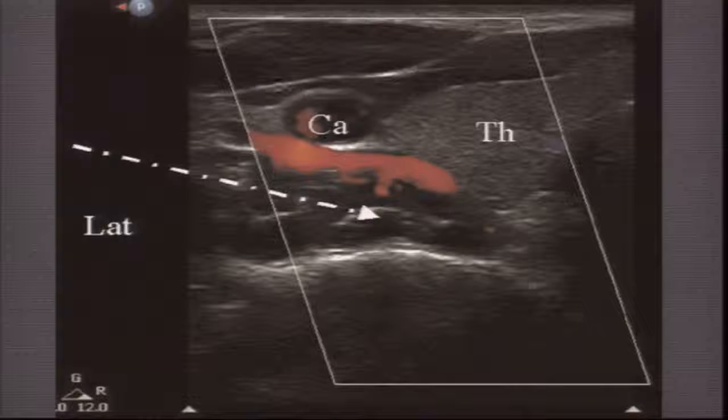Alternatively, under ultrasound guidance, after verifying Doppler flow to identify where the vessels are, a needle approach that comes in from a different angle can be achieved that gets to the prevertebral fascia without damaging these soft tissue structures and allows you to do an injection in the prevertebral fascia without damaging any of the thyroid, carotid artery, or other vascular structures in the area.